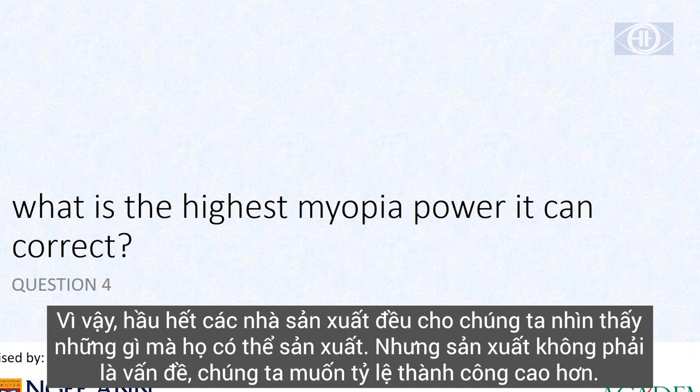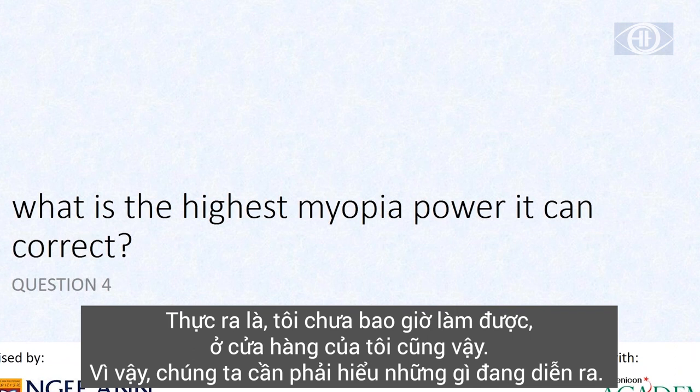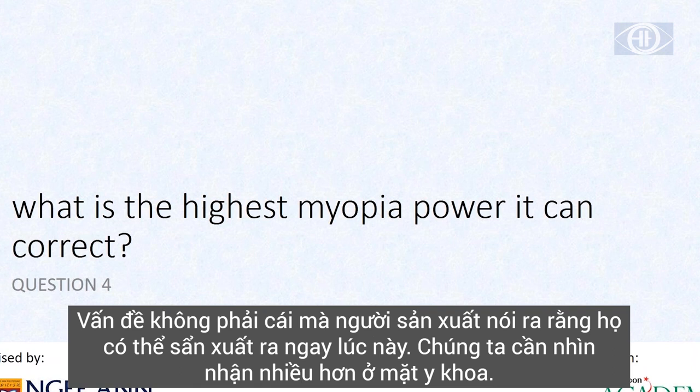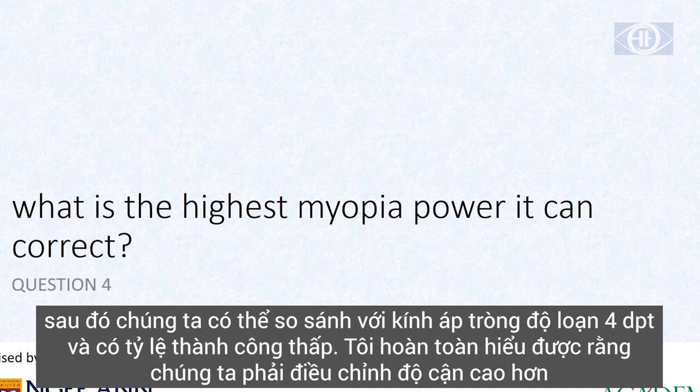If I have a patient in my chair, who of you in practice has fit a soft toric lens successfully with a cylinder of -12? Honestly, I never did. I never had someone in my store. So we have to understand what is going on. It's not what the manufacturer tells us, this is what we can produce. We have to look at this more clinically. Okay, fine that you can manufacture that, but what is reasonable, what is acceptable in our practice? And if we compare soft toric lenses, we end up with -4 diopters, and then we have a very low success rate.